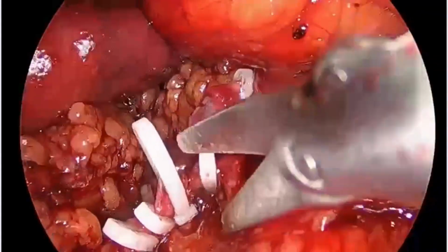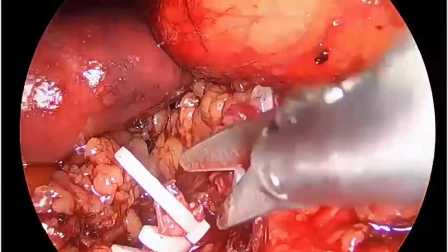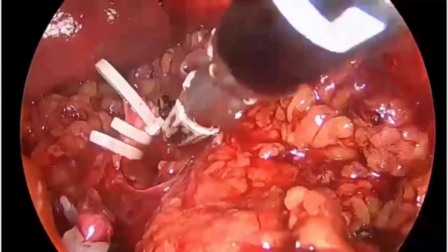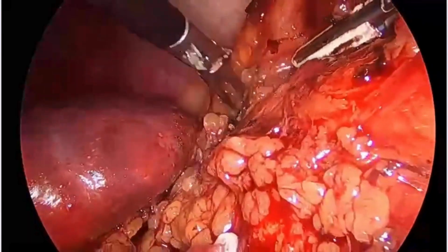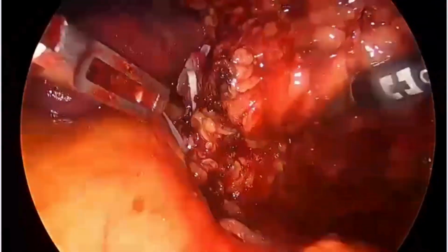And once the renal artery and vein were divided, we thought the job is over, and now it's just cut and dissect and remove the kidney. But because of multiple interventions, the actual story started here, because reaching up to this point it almost took 40-45 minutes, but the rest of the surgery took more than an hour because the intervention was extraperitoneal all the time.